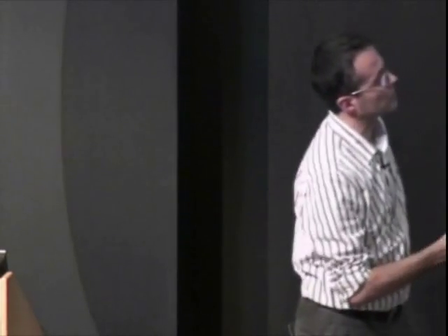Now, what's interesting is that whatever type of MR channels we have, and however many they can be, 6 or 10 or just 1, it doesn't matter. What we want to do is achieve this. We want to achieve what we call a semantic segmentation. Segmentation means delineation, the same thing. This is visualized in 2D because it's easier, but imagine all of this done in 3D, in the original coordinate system of the patient. The colors themselves don't mean anything. The fact that they're different is what's important.